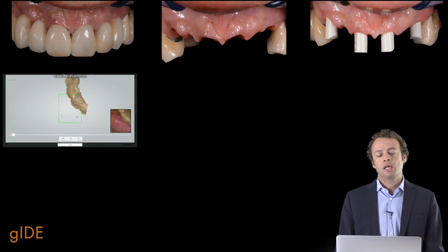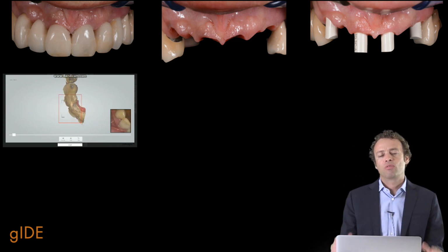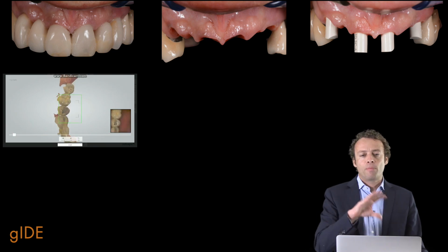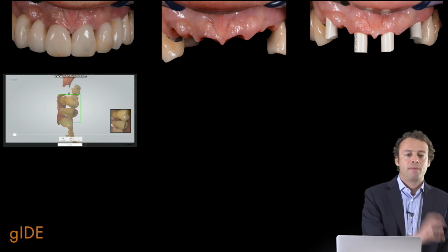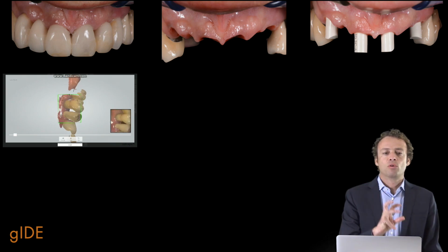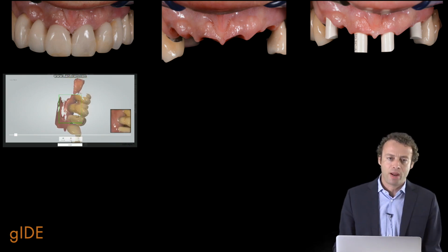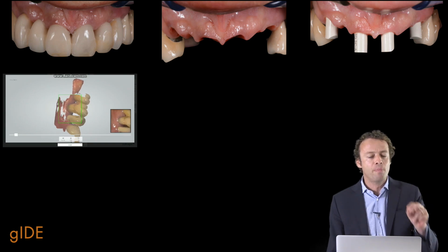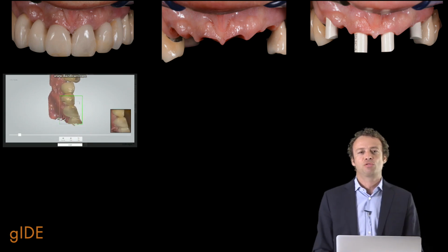of the temporary. In that way, the dental technician in the lab, with a completely digital workflow, will be able to copy exactly the morphology of the temporary that we have tested in the mouth per month. Once we have concluded this first impression, we work with a second impression that is finalized to copy only the soft tissue morphology, the ideal soft tissue morphology.